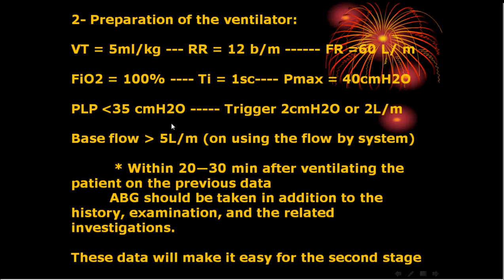You should set it empirically, and empirically with lung protective strategies. I mean that you take care. This patient might be COPD, bronchial asthma, or ARDS, or normal lung. So in this case, to cut it short, not to harm the patients, go with the lower tidal volume, not higher tidal volume.